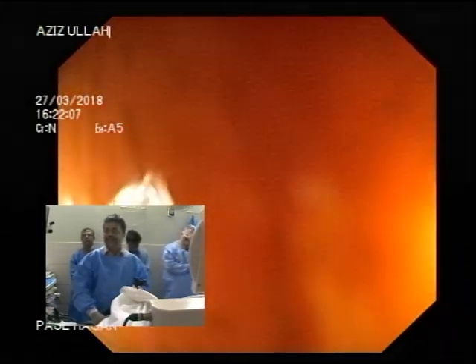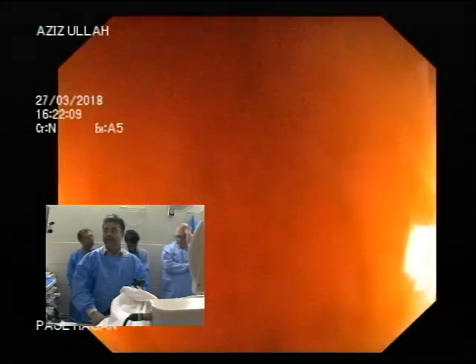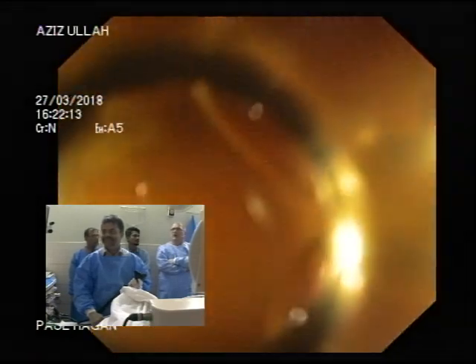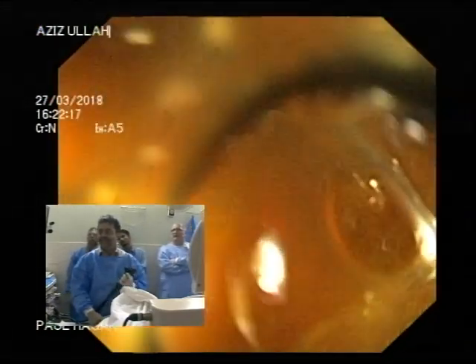Just a fold before. Right, my friend, so I'm just looking at the time. So we've been in, we've seen that it's normal. We need to take some sigmoid biopsies or rectosigmoid biopsies. So when we come back, but other than that, everything's normal. Yeah? What we've seen on the way in.